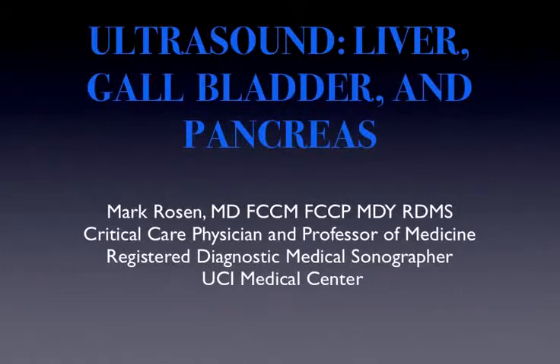Now, for those of you who are relatively new to ultrasound, I'll just give you my personal bias. I think clinically the ultrasound exam for the liver and gallbladder are quite important in the emergency department and in the intensive care unit as well as general medicine. The examination of the pancreas is somewhat more difficult, and we'll get into that in the lecture.